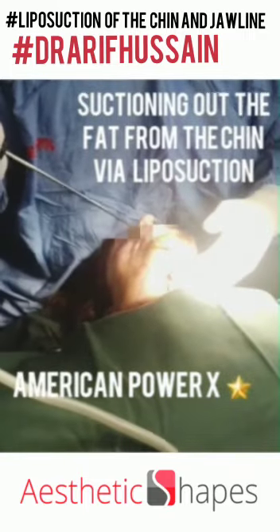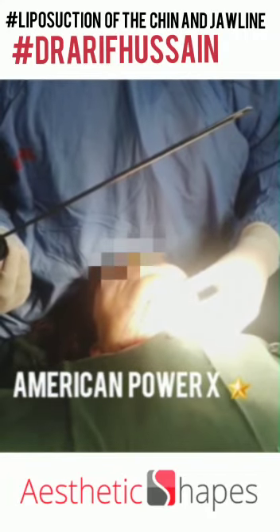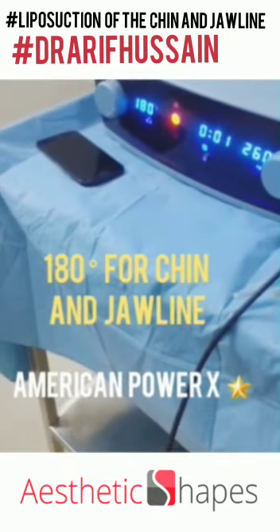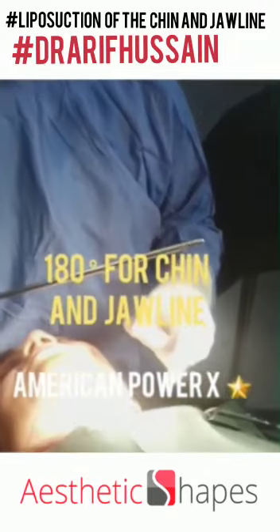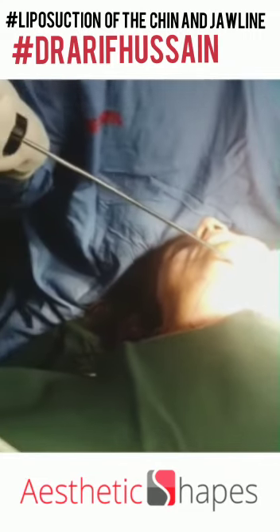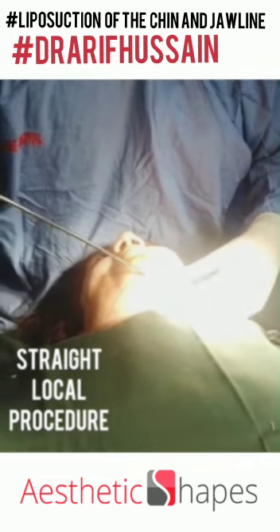We're doing lipo of the double chin and jawline using American Power X. The cannula is rotating at 180 degrees — in this procedure I use 180 degrees. We are doing this in a straight local. You don't need to push it.